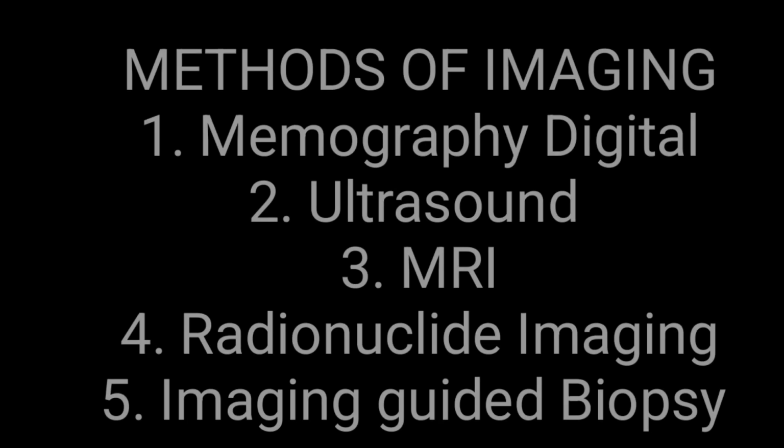The second baseline investigation, and also the investigation of choice for looking at the initial abnormalities and path of the abnormalities of the breast, is the ultrasound. Ultrasound gives you detail about the structural abnormality, the presence or absence of any pathology, and also localization of the lesion. You can confirm this on ultrasound quite clearly, and it's easily available, non-invasive, and a first line modality. So immediately it will help you out whether there is something suspicious or some pathology within the breast or not.